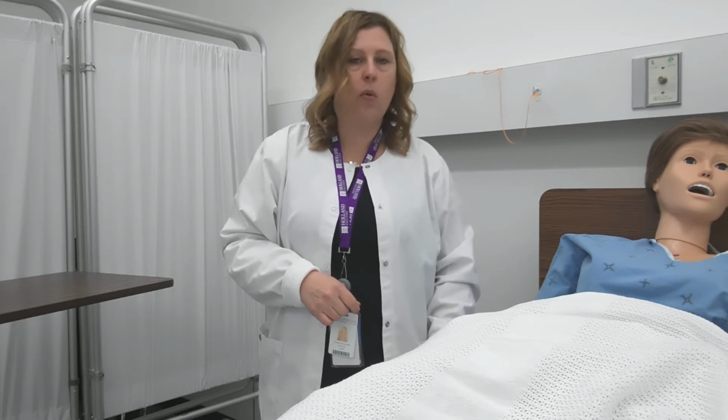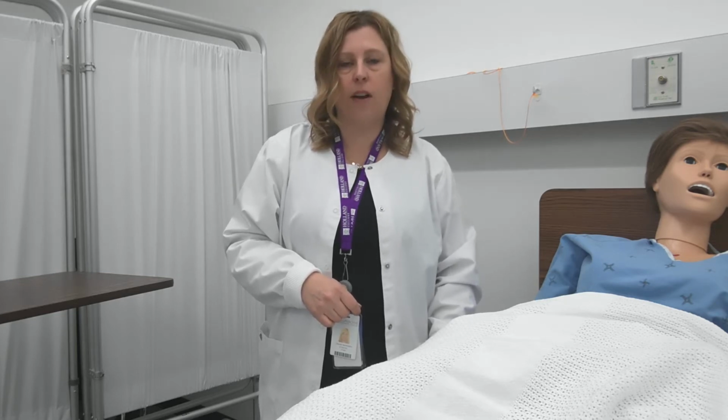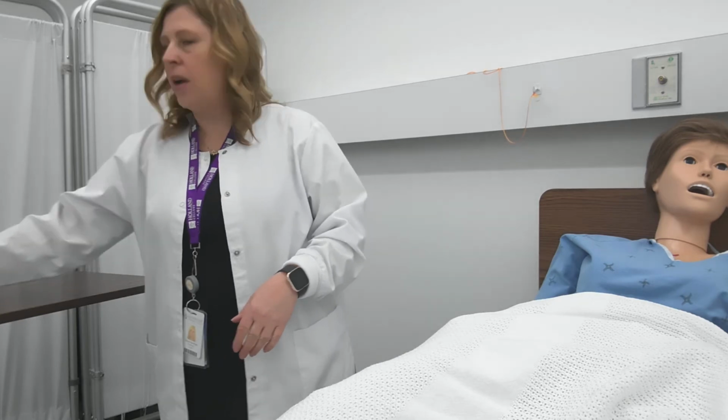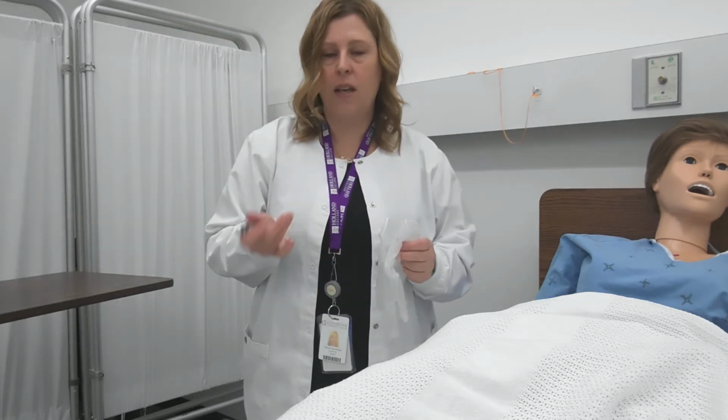When I enter the room, I'm going to ID my client using two identifiers. For this procedure, I'll be using medical asepsis. So the only supplies that I'm going to require is a pair of procedure gloves and a syringe.